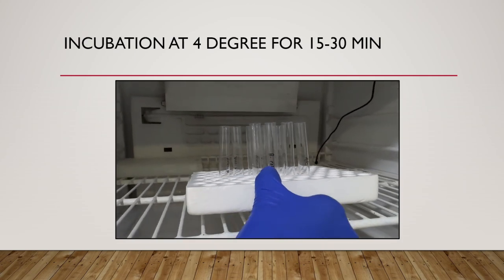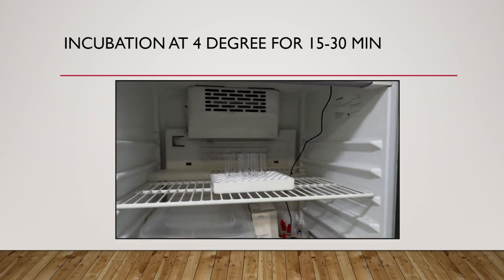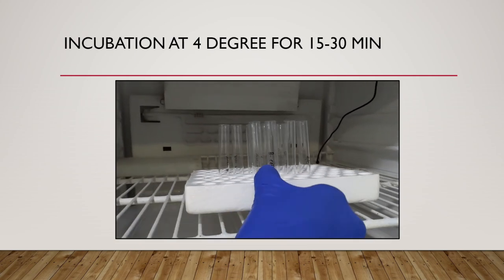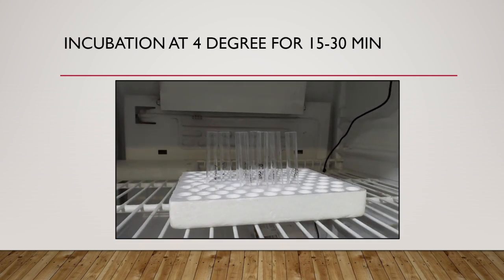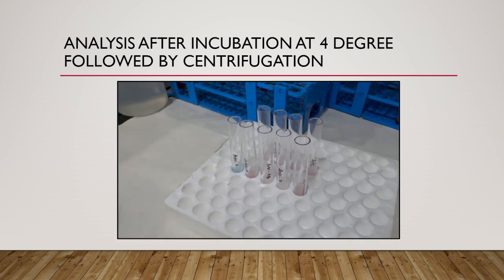After receiving a fresh patient sample, we will be repeating the previously done test at room temperature, and further we will be proceeding to incubation at 4 degrees Celsius at the next step. As per AABB guidelines, we will be incubating the tubes of both forward and reverse typing at 4 degrees Celsius for 15 to 30 minutes. After incubation, we will be proceeding with centrifugation. Centrifugation has to be done as per the standard operating protocol of the institution. After the centrifugation, we are going to analyze the results that we have obtained.